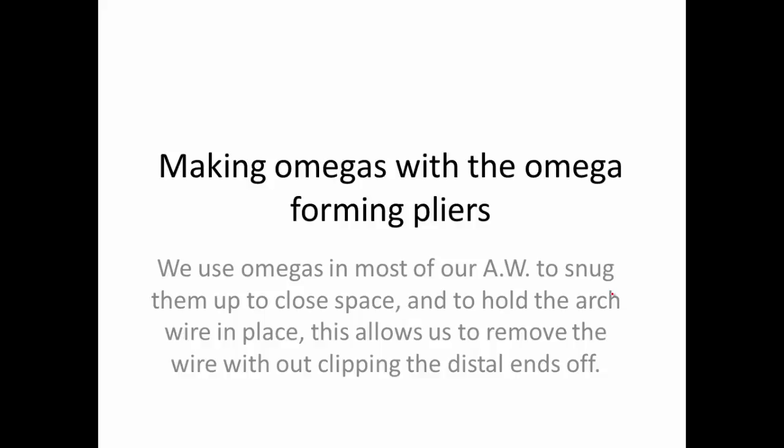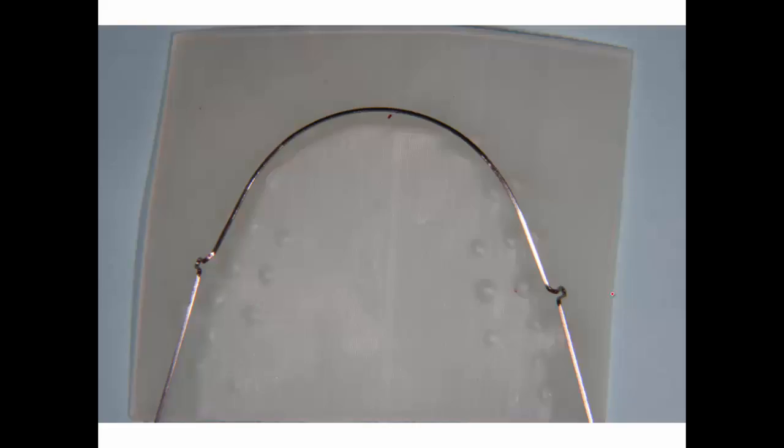I want to show you how to make omegas that we use on archwires, and I use them most of the time in doing our orthodontic work. I'm going to start out with an archwire. This is one that's already built, so we make a wax pattern and mark where we want these omegas to be formed. I'm going to show you how we make these.